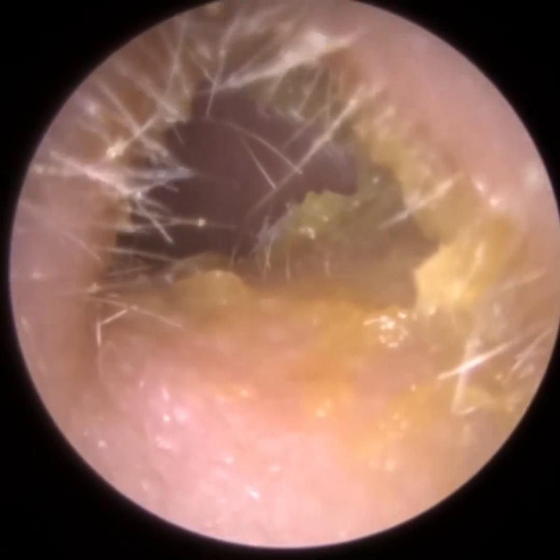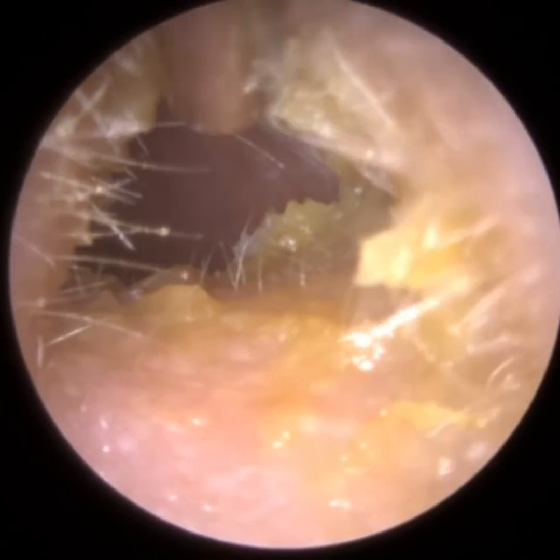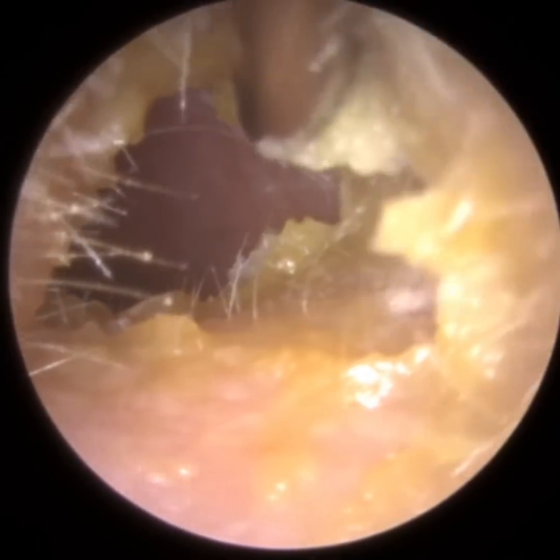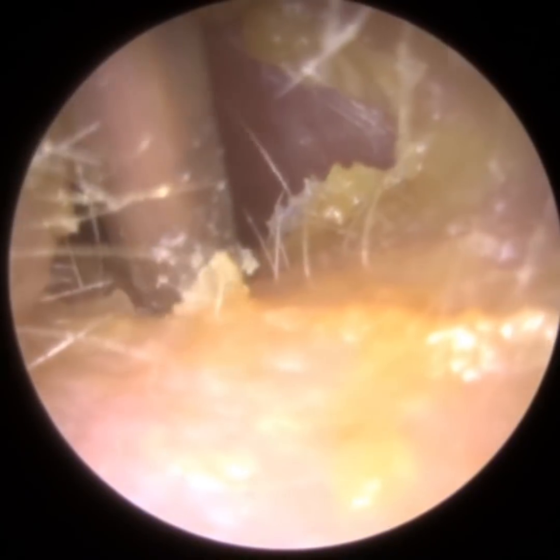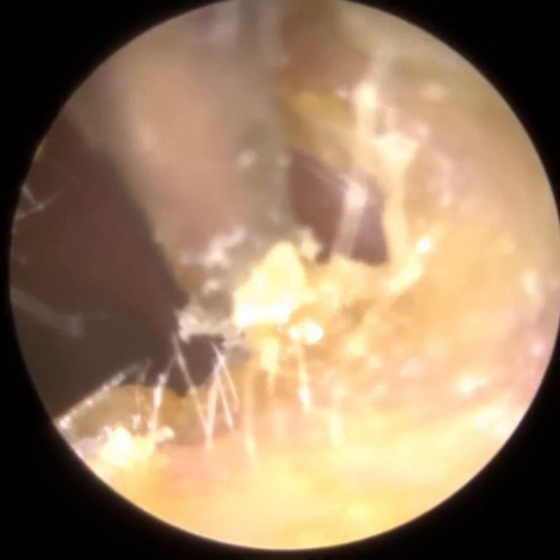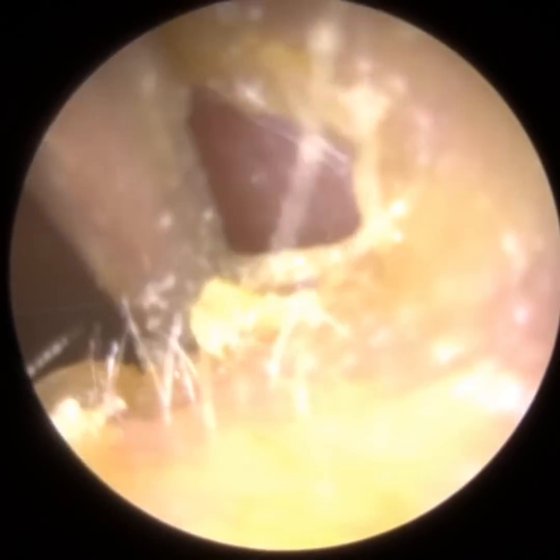Now, the right ear's done. This is the patient's left ear, and you can just tell by the entrance that this is a lot more inflamed. There wasn't as much occluding debris, just a bit of debris more laterally, blocking the entrance where we are here. We've removed that already.